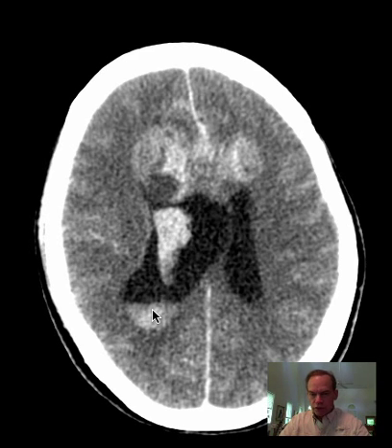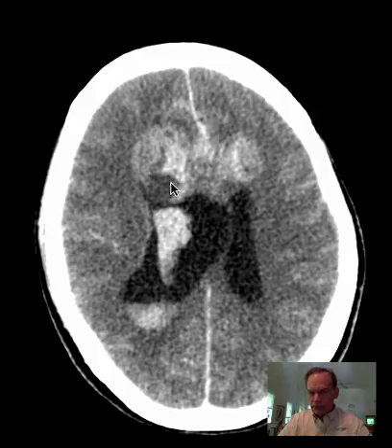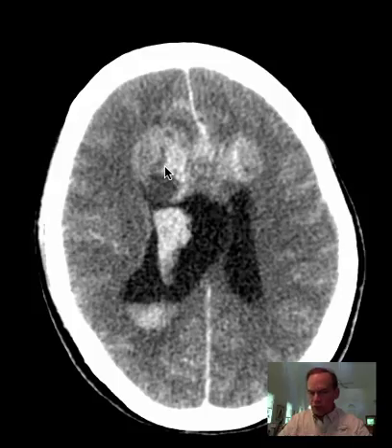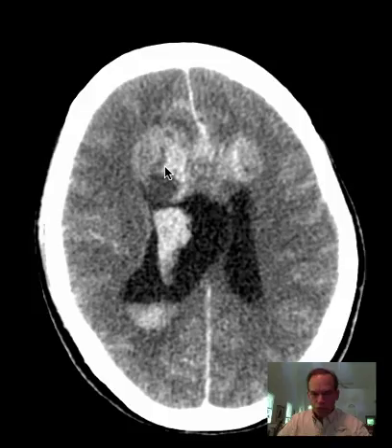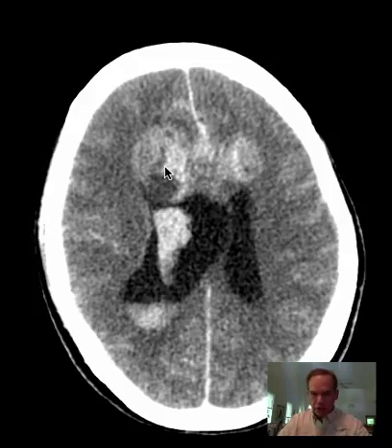My first impression would be that this is a neoplasm, and it's most likely a glioblastoma multiforme extending across the midline through the anterior portion of the corpus callosum. I can't tell quite yet on these axial-only CT images if it's through the genu or the rostrum, but we can see that better on an MRI.